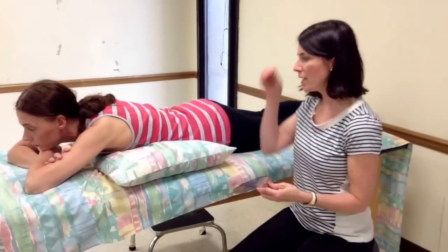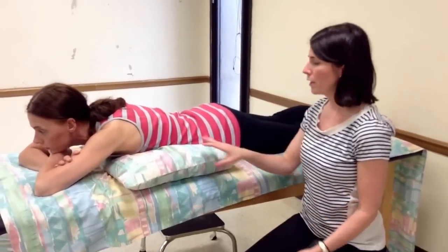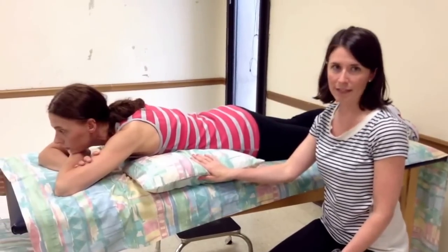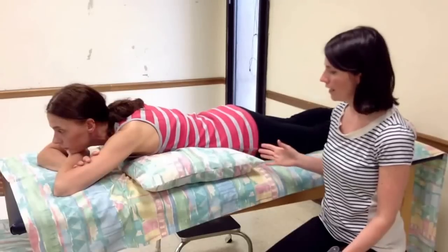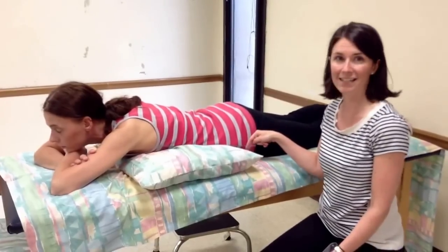The patient is going to be lying prone and we're going to place a pillow underneath her abdomen to help protect her low back. It's key that the pillow is high enough so that her ASISs are still firmly planted in the bed.